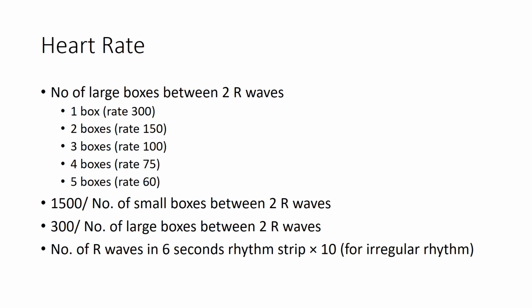This is a crude method, easily applicable, but less reliable and less precise.